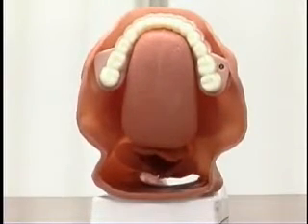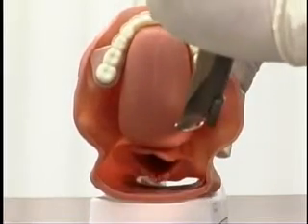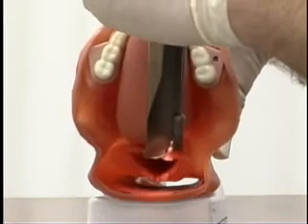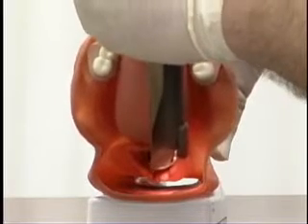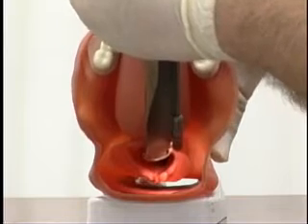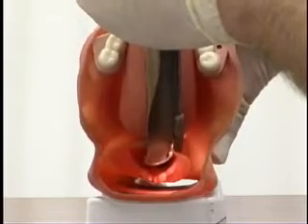We also have the Miller blade, which is a different type of blade. No matter what size Miller blade you have, it is placed in the same manner every time. Except with the Miller, instead of using that space — the vallecula — we're going to actually pass it down the right side, down the base of the tongue. We're going to put the blade directly underneath the epiglottis itself, and we're going to lift the whole thing up — the epiglottis and the tongue — and visualize the vocal cords.